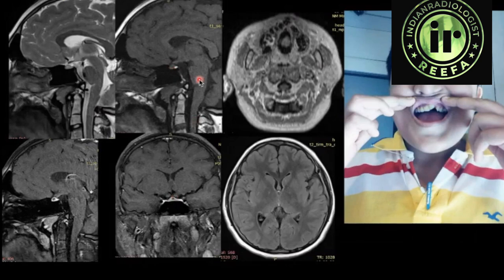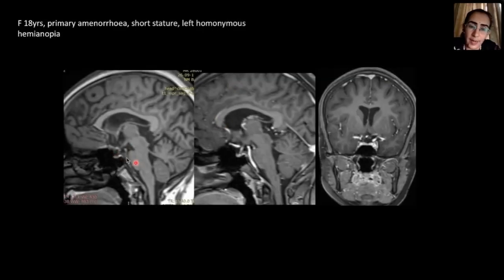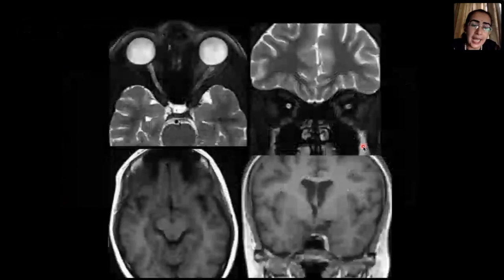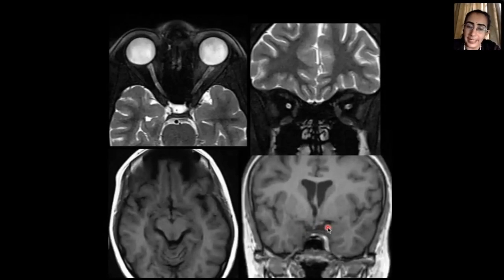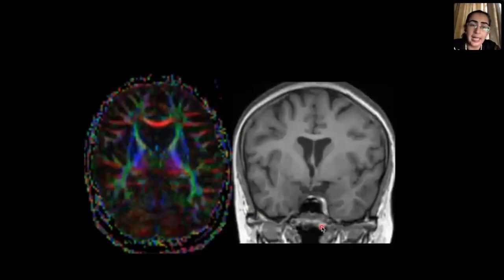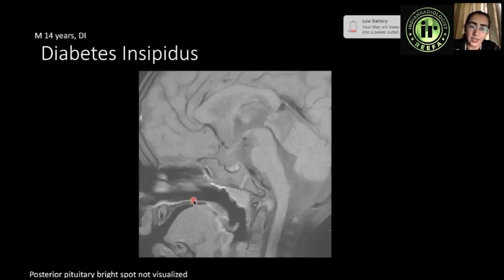In another short stature patient, the adenohypophysis is hypoplastic and the right optic tract is not myelinated compared to the well-myelinated left optic tract. On DTI images, differential signal intensity of both optic tracts and optic radiations is clearly demonstrated, confirming asymmetric myelination of the right optic tract and radiation.